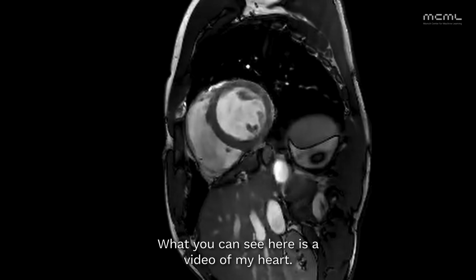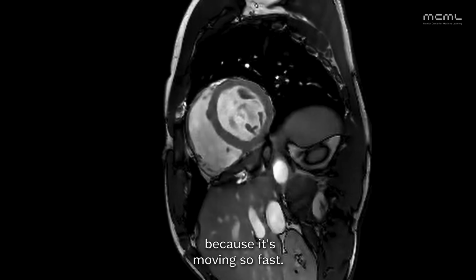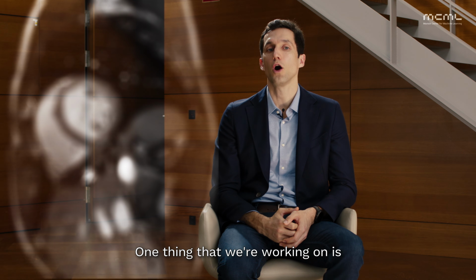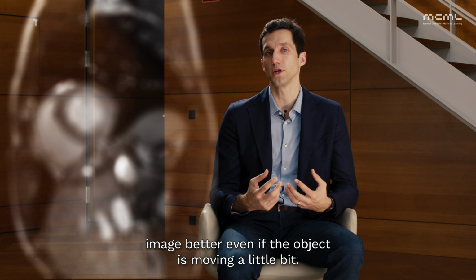What you can see here is a video of my heart. That's something that's very hard to reconstruct because it's moving so fast. One thing that we're working on is how can we get higher resolution and image better even if the object is moving a little bit.